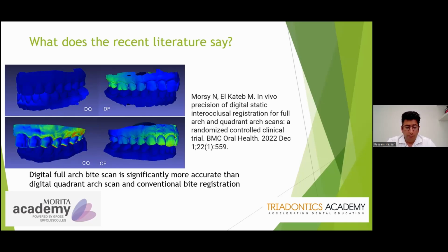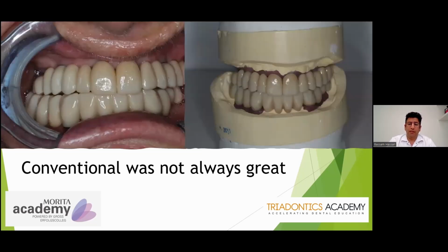For many years, we were maintaining the view that bite registration with intraoral scanners is wrong and is inferior to taking upper and lower impressions, having a model and making a scan in the lab. But recent literature has now proven what everyone else already knows, and that is that intraoral scanners have become amazing in capturing bite. I mean, conventional, let's just be honest, was not always great.